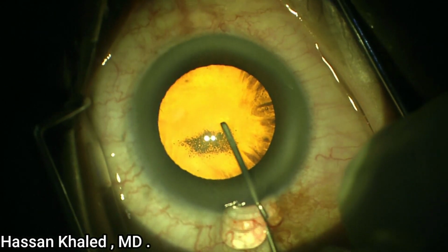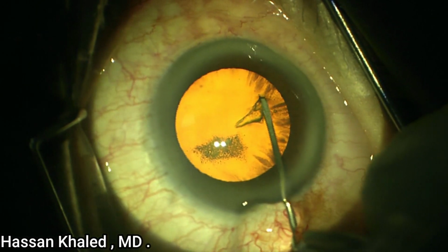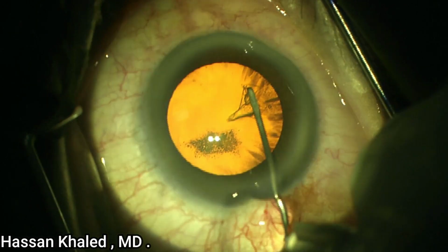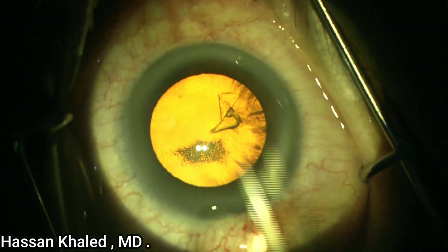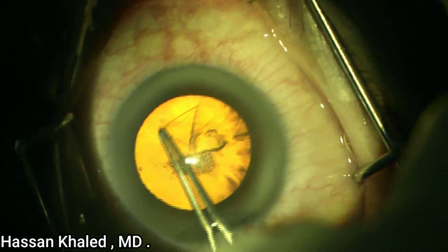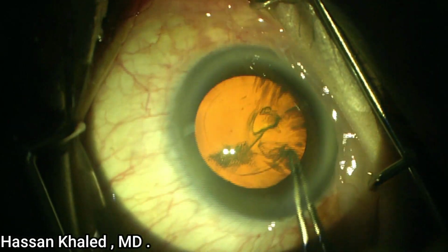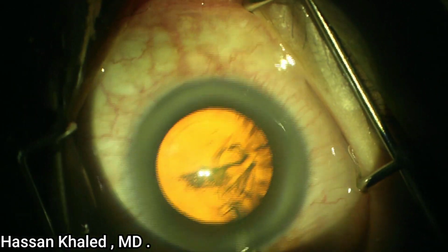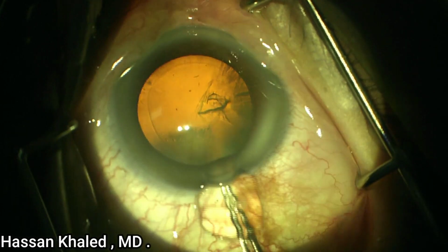And you can see at the same time the pupil is viscodilated, now using the cystotome to create a small flap in the anterior capsule and continue the capsulorhexis using the capsulorhexis forceps. Actually, the ideal rhexis should be between 5 to 5.5 millimeters in diameter to overlap the edge of the IOL by the end of the surgery to secure the IOL inside the capsular bag.